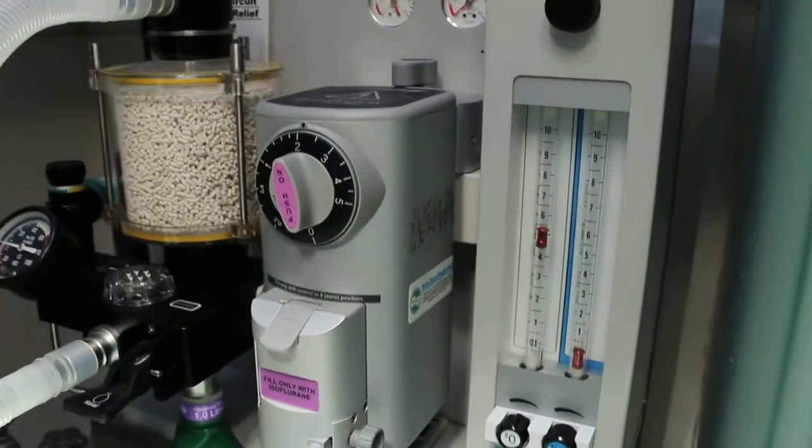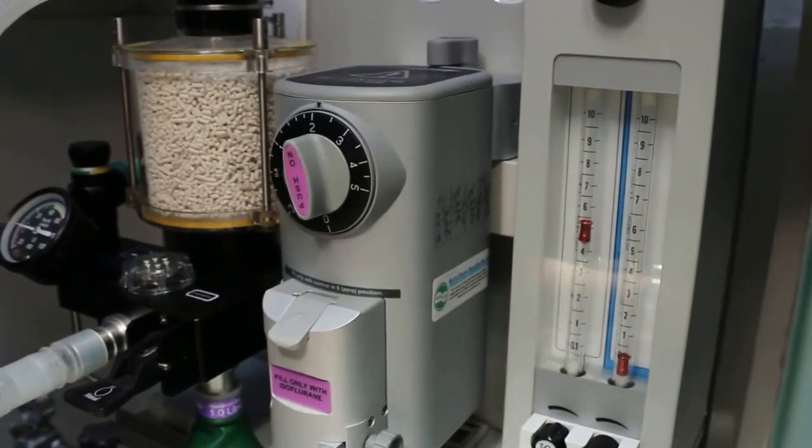I put anesthesia, isoflurane gas at 5%, then it's down already — it's sleeping.